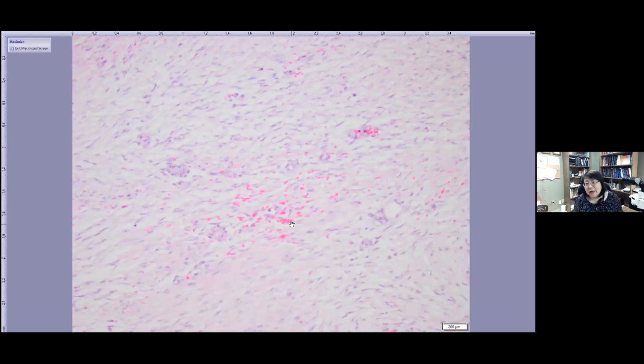Different from regular nodular fasciitis, nodular fasciitis is usually beta-catenin negative. Infantile cranial fasciitis is usually beta-catenin positive, and usually more aggressive, and sometimes invades the bone and really mimics malignancy.